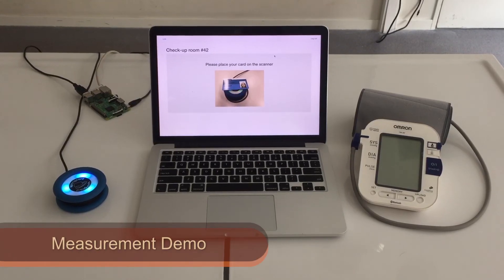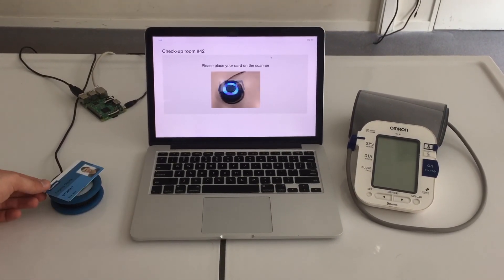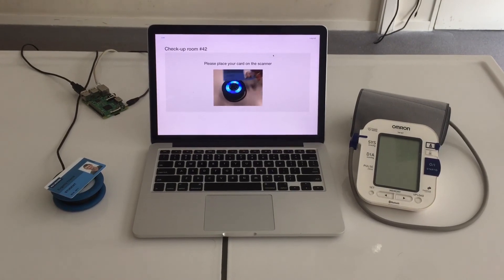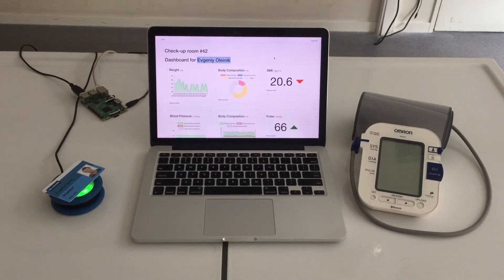Taking a measurement is simple. Just put your card on the scanner to see your personal health dashboard.